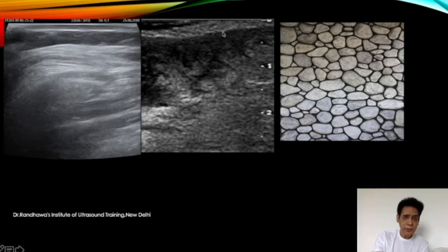Now, when you find dermis being thick and irregular, it favors cellulitis rather than simple edema. Now, the other thing you can make out is with Doppler, once you put color, you can see there will be patchy areas of flow along these bright areas which represent the fat.